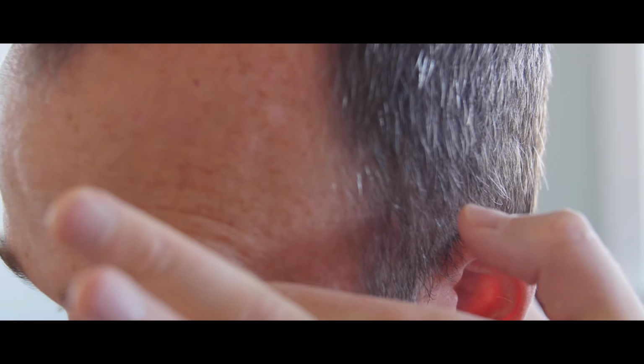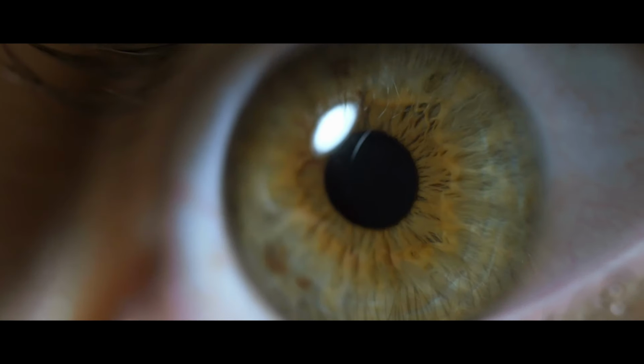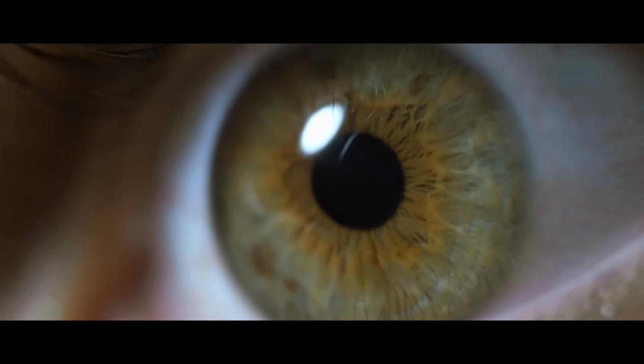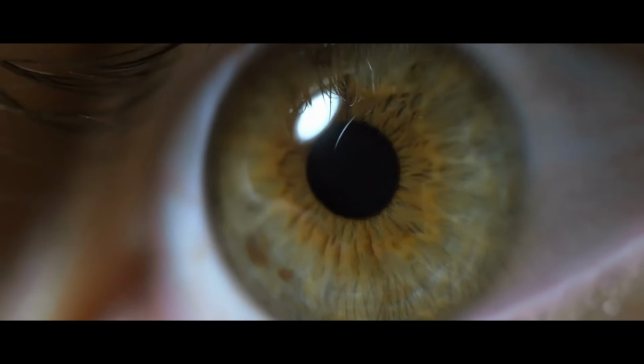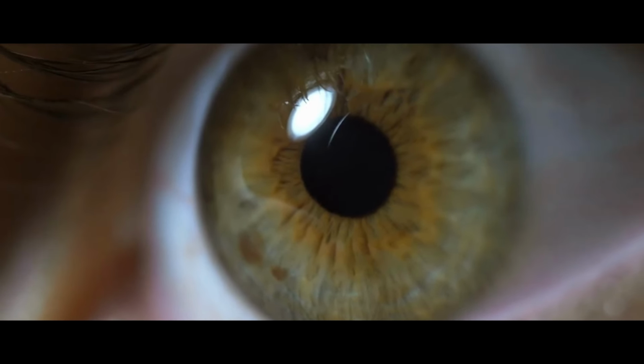Last but not least is wearing your contact lenses for too long. I have seen people wear contact lens when they are sleeping, which is really bad, because when your eyes are closed, your eyes cannot get enough oxygen, and when you put a foreign particle inside, it's going to be really bad for your contact lens and for your eyes. And number one reason for eye infection is sleeping inside your contacts.